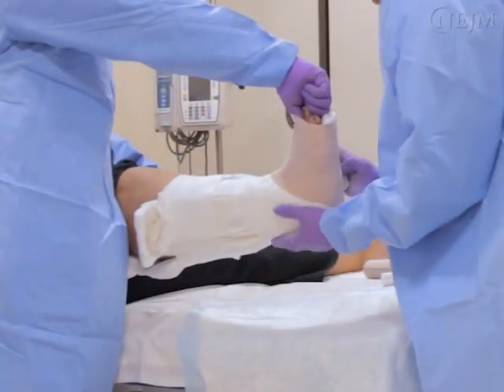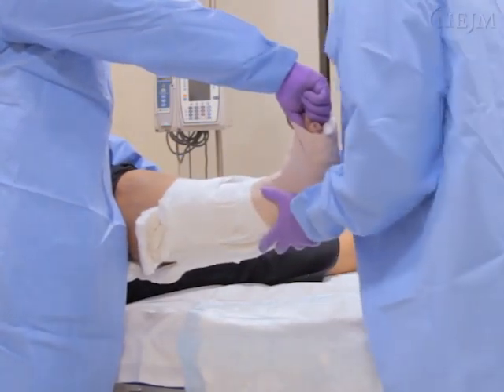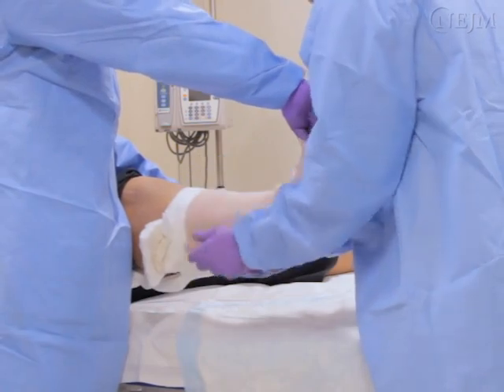Wrap these slabs very loosely with an elastic bandage. It is crucial to avoid stretching the elastic bandage as it is applied. Stretching the bandage can cause pain and may even cause compartment syndrome.